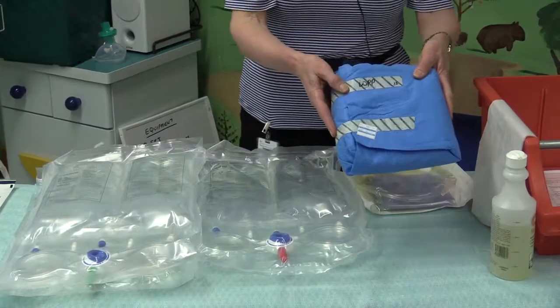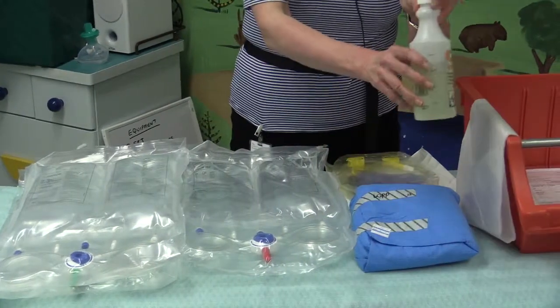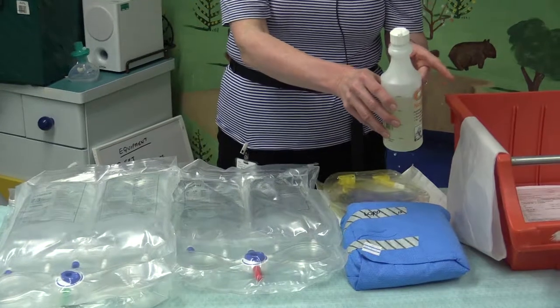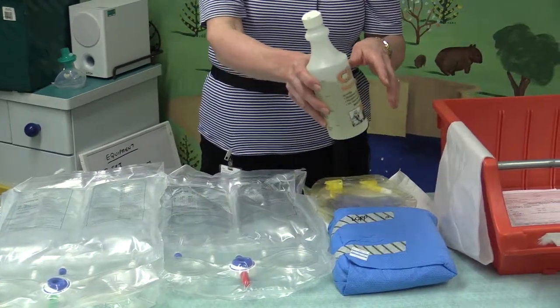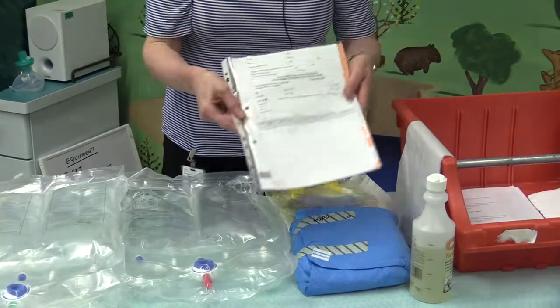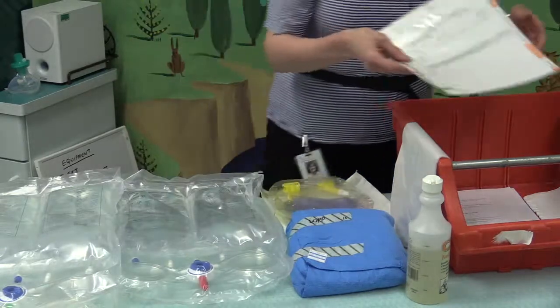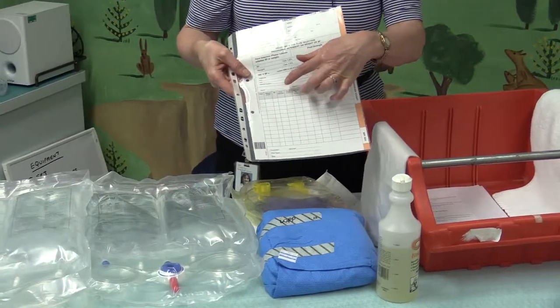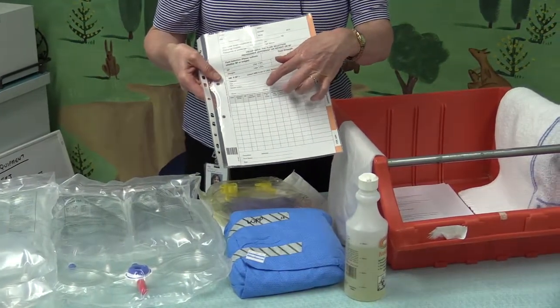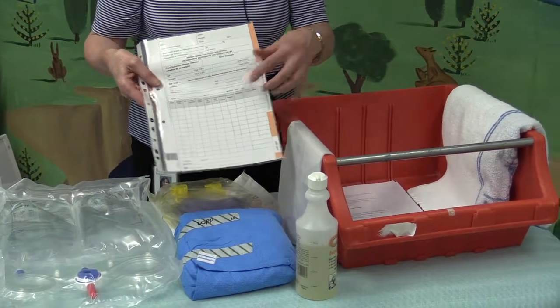A gown for the person that's setting up the equipment. Some disinfectant for cleaning the dressing trolley and the equipment that we're going to use for the dialysis. We will need a peritoneal dialysis chart with orders on it, and you'll continue to use that to record the fluid that's going into the child and the return and the ultrafiltration balance.